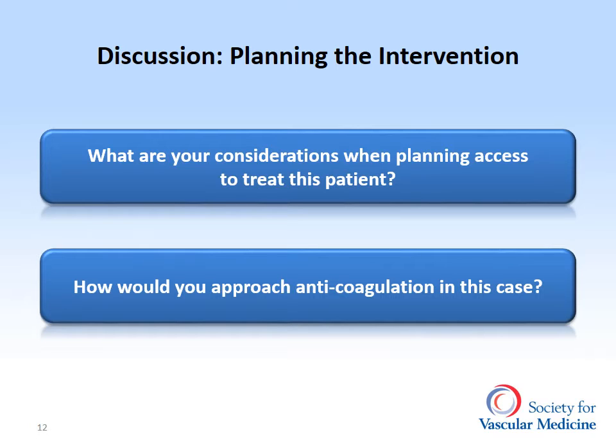The contralateral up and over approach allows reentry into the external iliac artery and allows protection of the unaffected common iliac artery from jailing. However, there is less support and it may be difficult to treat the iliac in question in the setting of severe aortoiliac angulation. A radial or brachial approach provides somewhat less support but allows entry directly into the external iliac artery. There are sometimes difficulties with arm and operator positioning when using these approaches.